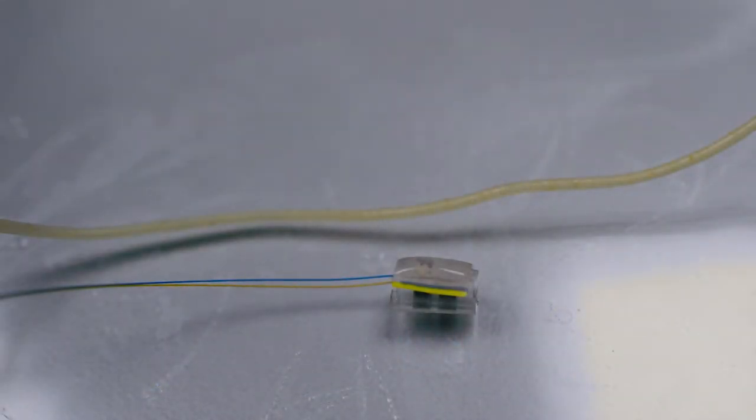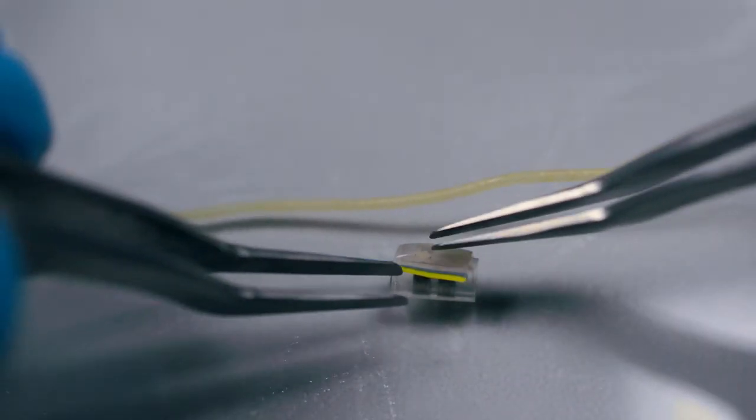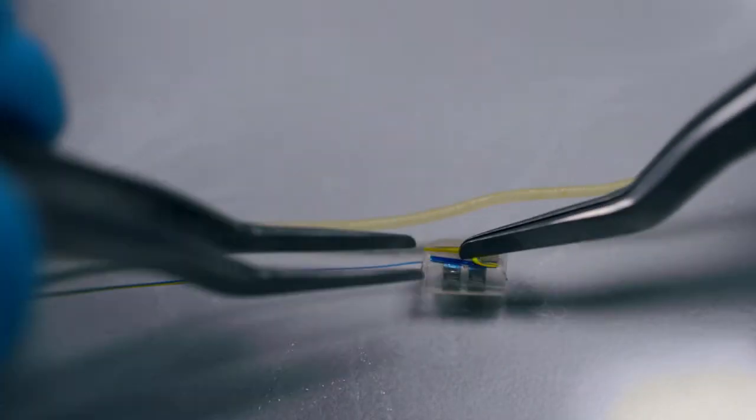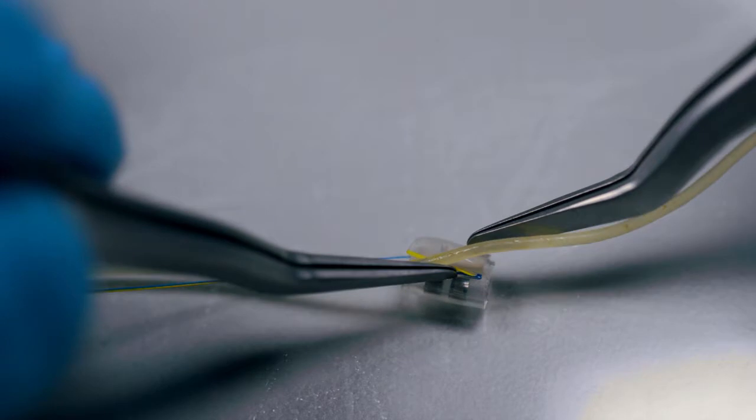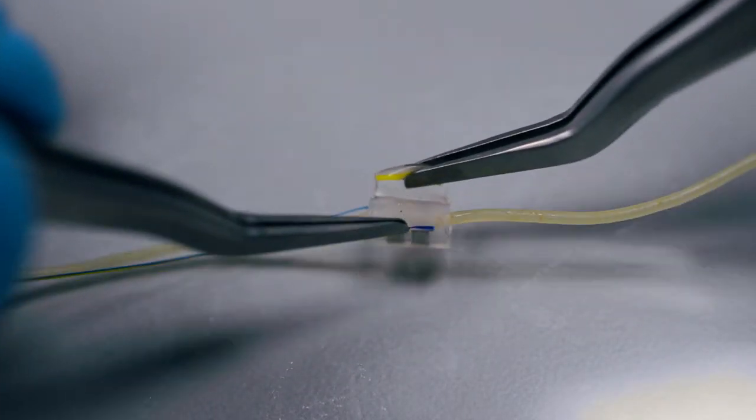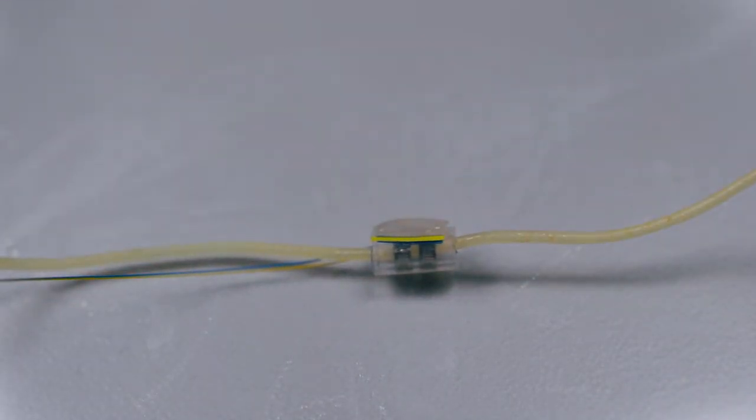First, position the cuff parallel to the nerve. Grab the cuff by its colored flaps and open it. Gently pull the yellow flap underneath the nerve and let the cuff close by itself. If you think the cuff requires some extra push for a perfect closure, do this with the tweezers.